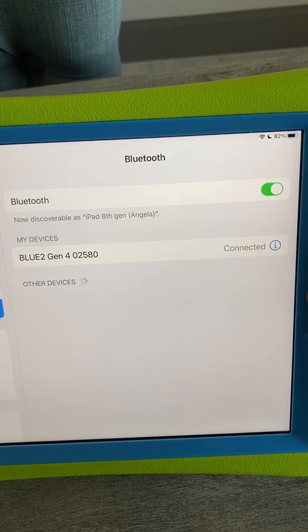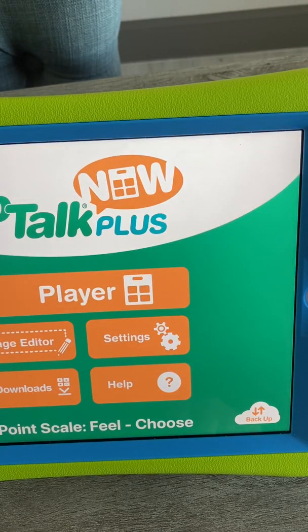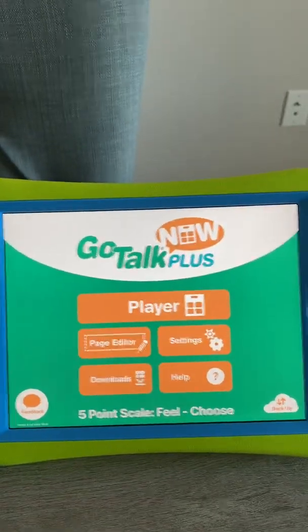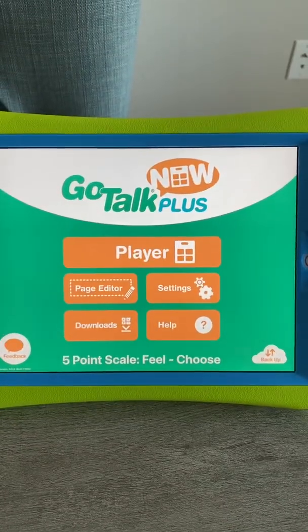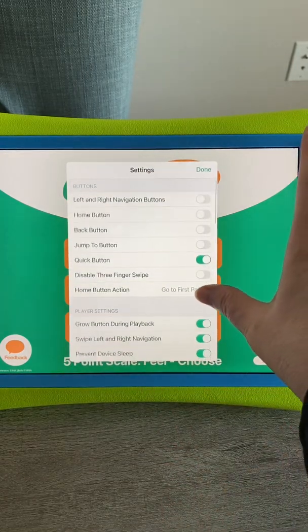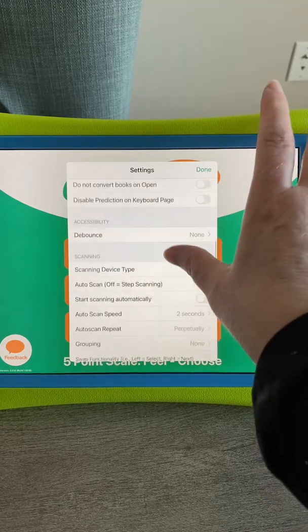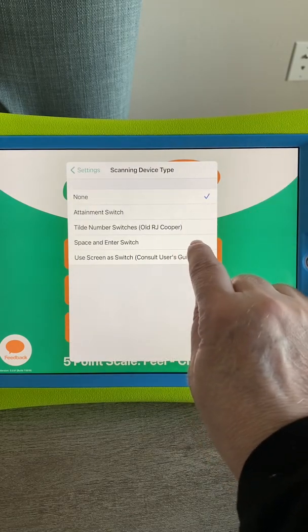So next, I'm over here in GoTalk — this is GoTalk Plus, but it works the same in GoTalk Now or GoTalk Plus, or probably even the free version. I'm going to go into my settings and go down to scanning, and here's another critical piece.